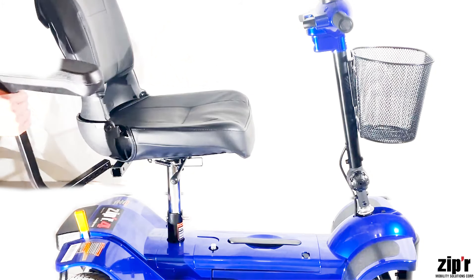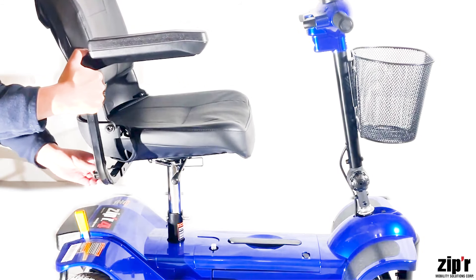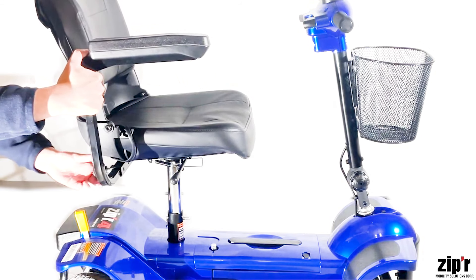Now let's put the armrests in. Grab the armrest and place it into the armrest slot, tightening it with the screw.